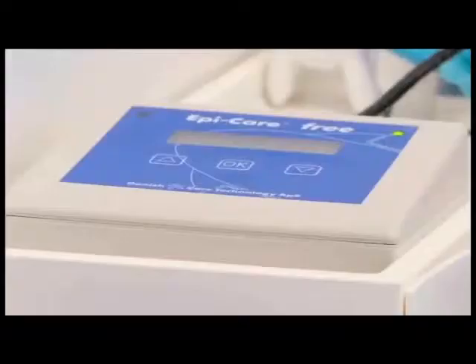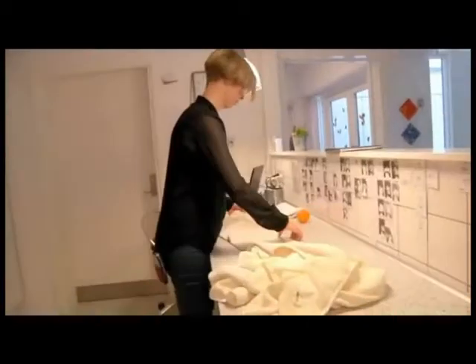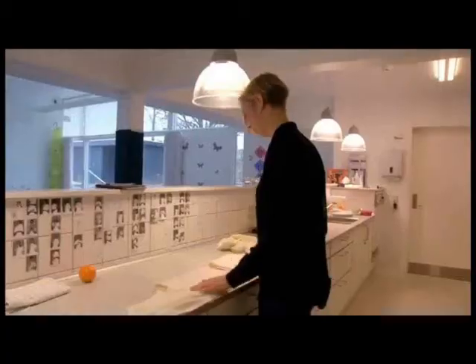The armband triggers an alarm and sends signals to the EpiCare control device. From here, a call is made to the designated caregiver — for example, to the caregiver's mobile phone.